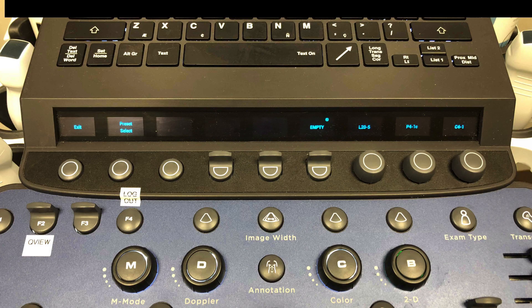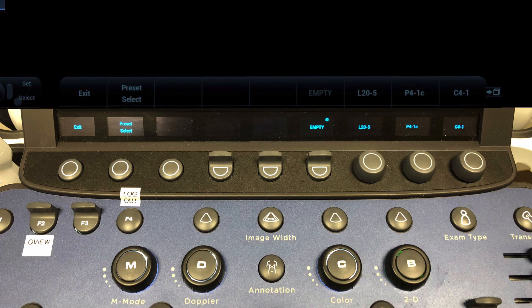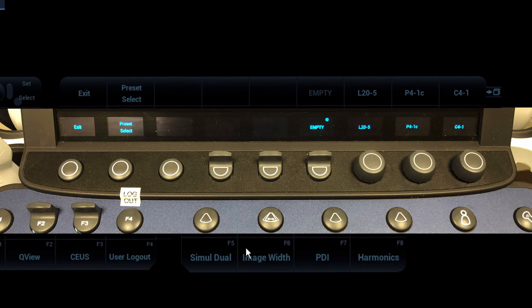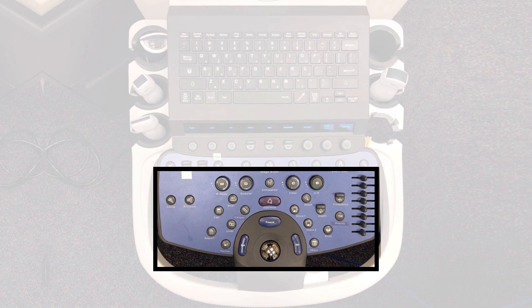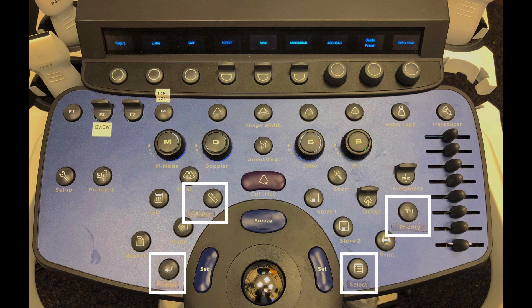There are two rows. The OLED soft keys are displayed on the top row of the menu indicators, while the function keys are displayed on the bottom menu indicator row. Below these areas are the operational keys that adjust the ultrasound image and control modes. Some buttons have changed name and function: the measure key is now the caliper button, the enter key is now the pointer button, the harmonics key is now the priority button, and the menu key is now the select button.